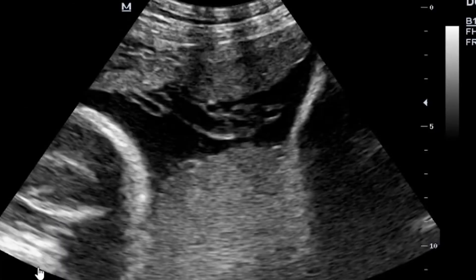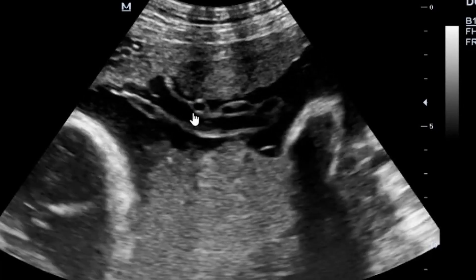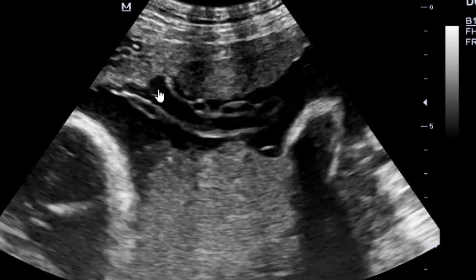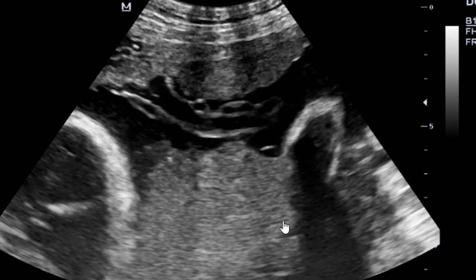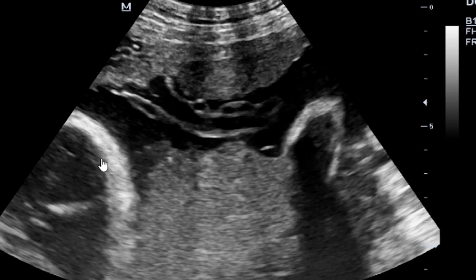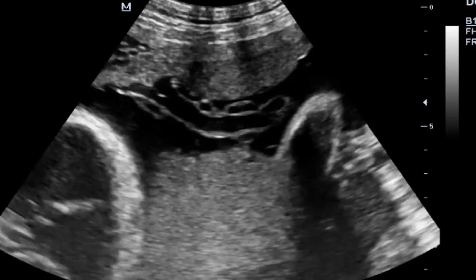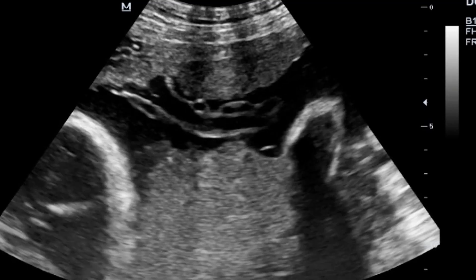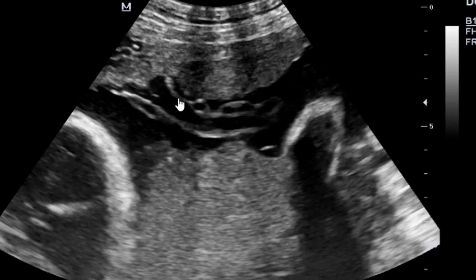When you are doing an ultrasound scan, it is very important to assess the attachment of the placenta and at the same time to assess the attachment of the cord itself, because you might only be checking for things like placental abruption and not checking for other conditions like velamentous cord insertion, which can also cause complications to fetal life in utero.